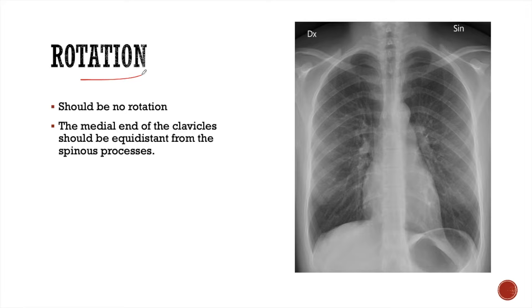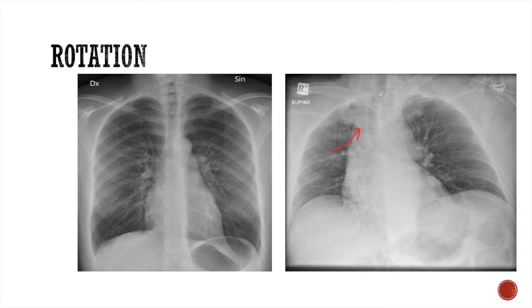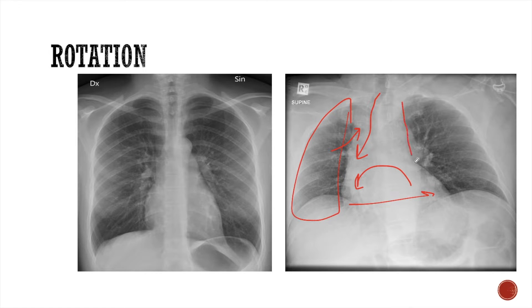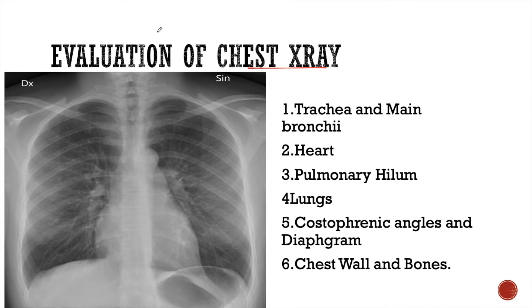The next factor to consider is rotation. There should be no rotation in an optimally centered x-ray, meaning the medial ends of the clavicles should be equidistant from the spinous process. When the x-ray is rotated, the trachea appears displaced towards one side, the heart also appears displaced, and one lung appears smaller than the other. This may obscure pathologies in that lung, so we should check for no rotation in an x-ray.